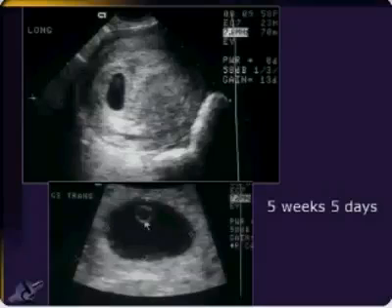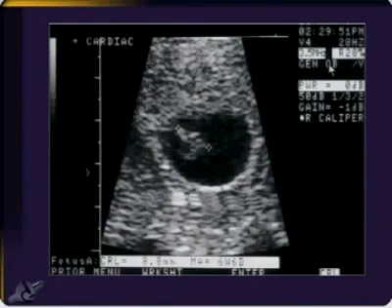She now goes away, comes back, and all right, it's 2:30 in the afternoon, but guess what? It's Saturday. Resident number 4 scans her at this point. Now, resident 4 doesn't do a transvaginal scan, but that's okay because this is a well-documented pregnancy. We now see a little embryonic pole there, yolk sac, 6 weeks, 6 days. My point here is things change drastically in the first trimester in a very short period of time. And short follow-ups, 2 to 3 days, you can see dramatic changes in a normal pregnancy.